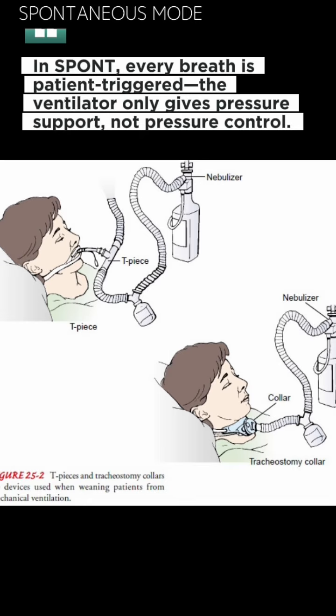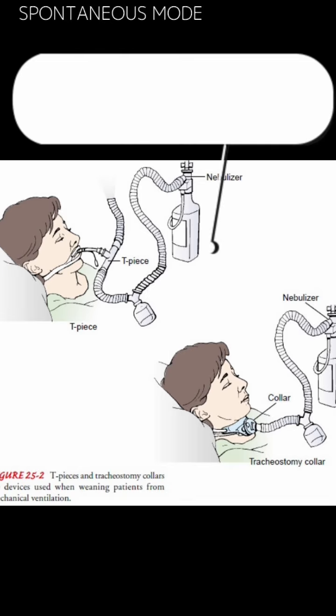The ventilator just gives the pressure support. There is not any pressure control in it. All the volume inhaled is by the patient. The ventilator just supports his breath, providing pressure.